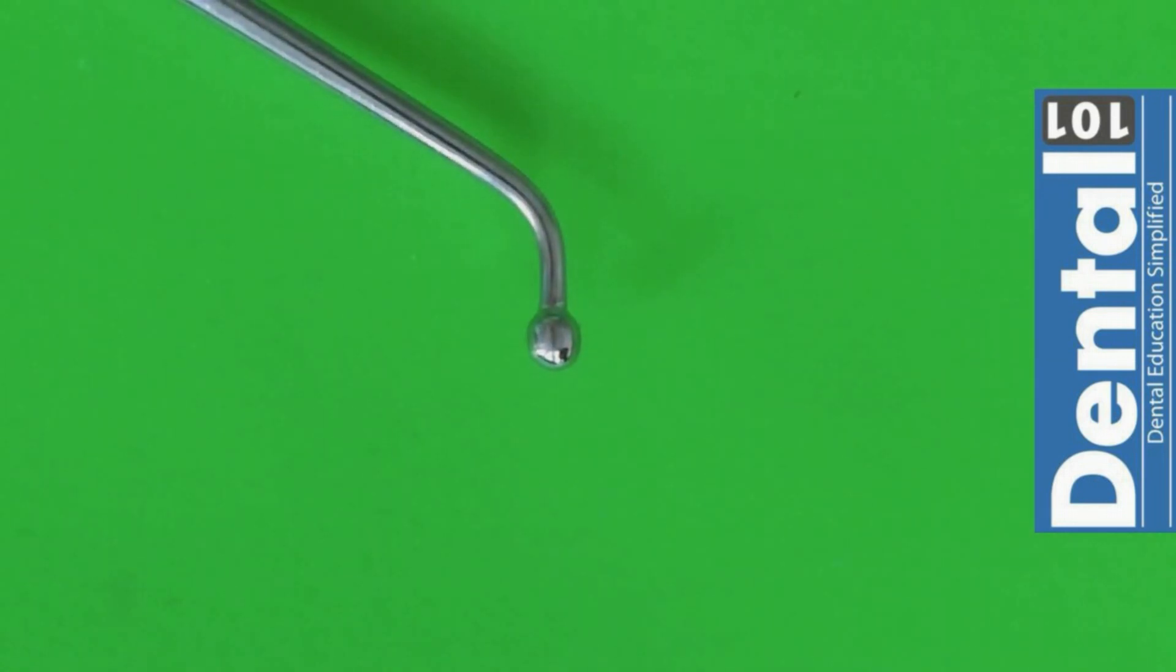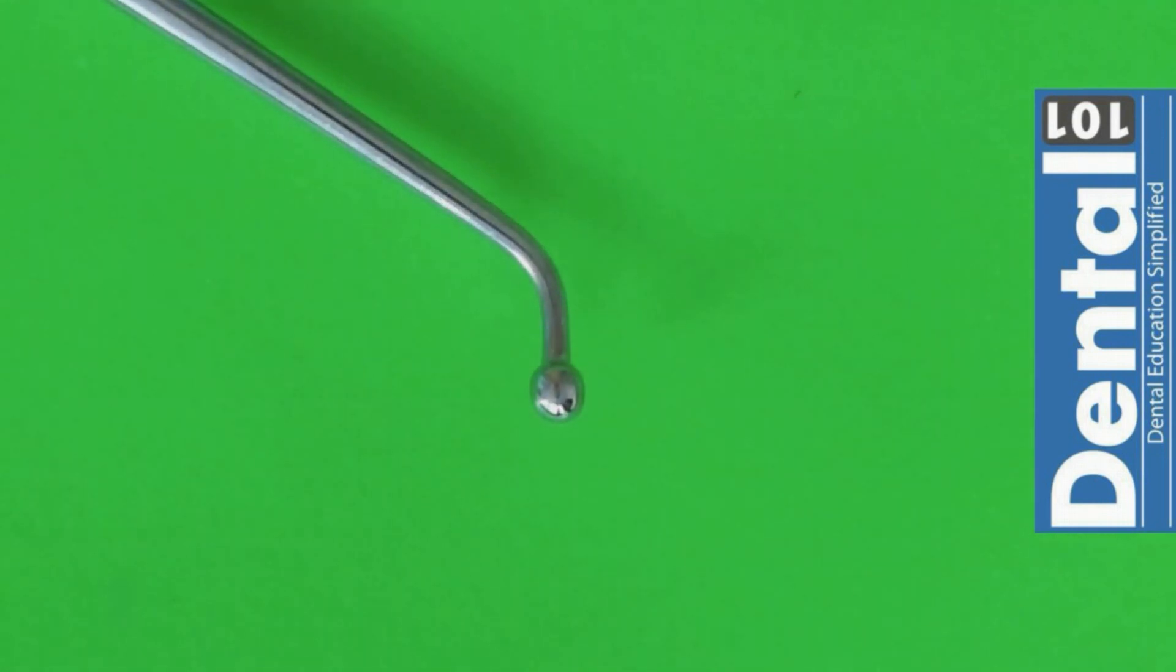Here we have the ball burnisher. You have two working ends. One ball is going to be longer or bigger than the other one. The use of the ball burnisher is to ensure that the margins of the amalgam are adapting quite well. Also you can use this one to smooth the amalgam after you have condensed it. And remember that we also use the ball burnisher when we are placing our matrix band so we can contour the matrix band in the interproximal surface.